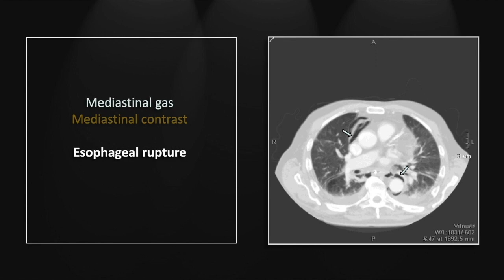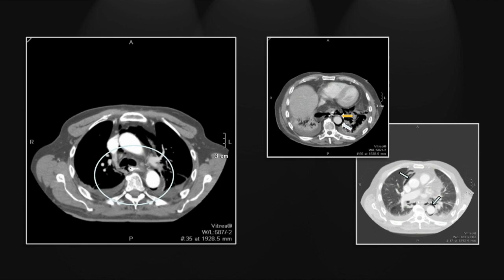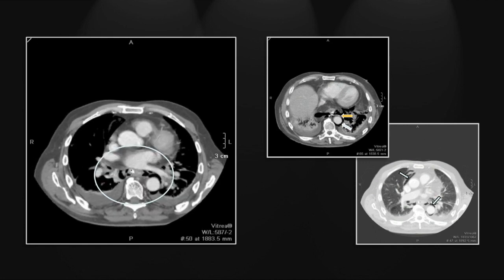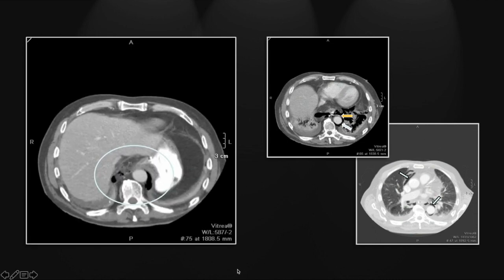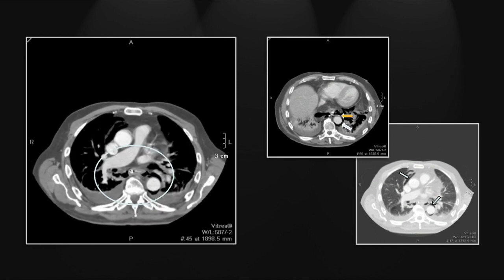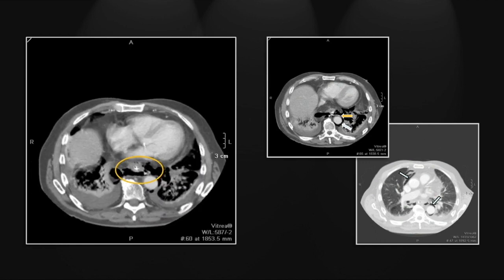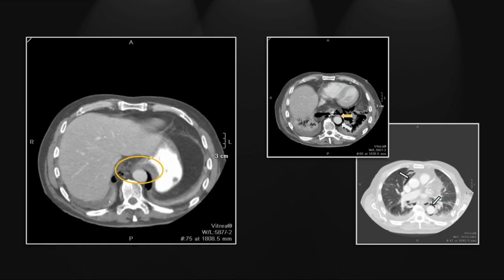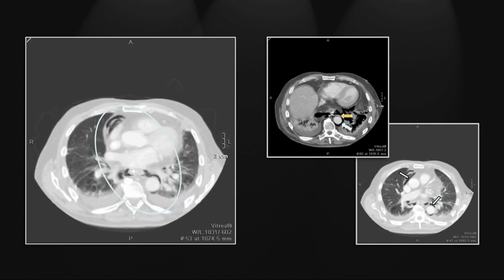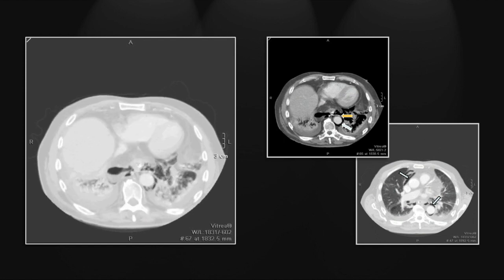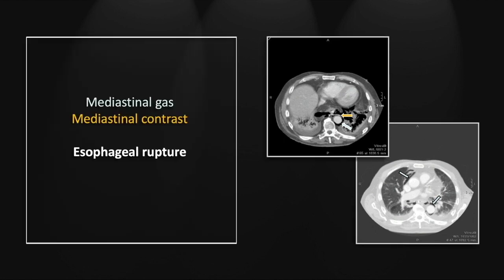And there is a lung window for better appreciation of that pneumomediastinum. Let's follow the esophagus first, noting all that gas surrounding it and outlining its outer aspect very nicely. Now let's appreciate that contrast there on the posterior aspect of the esophagus, and the extensive pneumomediastinum as seen on lung windows. So that is a case of acute esophageal rupture, or Borhoff syndrome, again associated with extensive pneumomediastinum and extravasation of contrast.